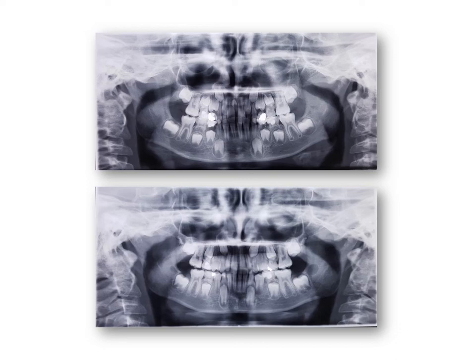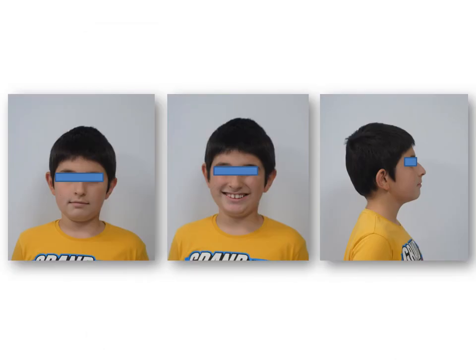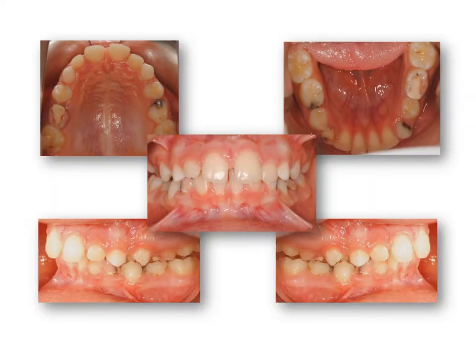on the panoramic x-ray. This is his smile and the profile after wearing the twin block for almost a year, and the changes in the occlusion. We are almost in class 1, but the bite is still deep.